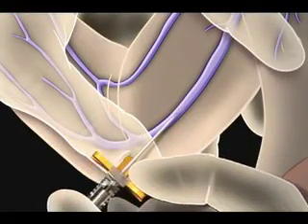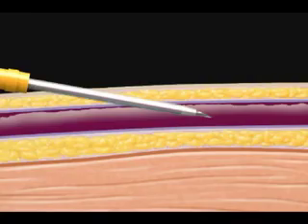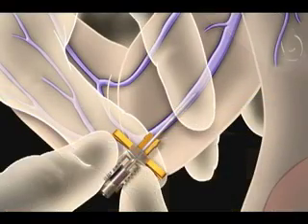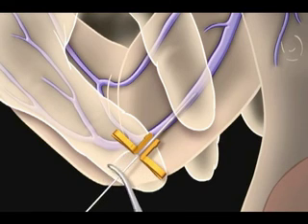Puncture the vein with the introducer needle. Observe for blood return. Stop advancing the needle once you observe blood return, lest you puncture the posterior wall of the vein. Withdraw the needle when using a peel-away sheath, then insert the catheter through the introducer to the appropriate pre-measured location. The catheter should advance with ease.